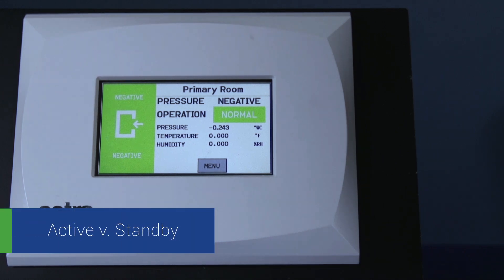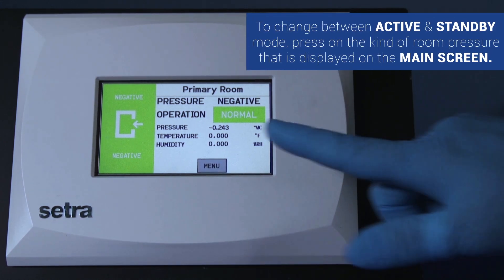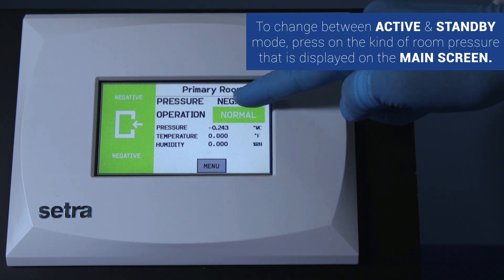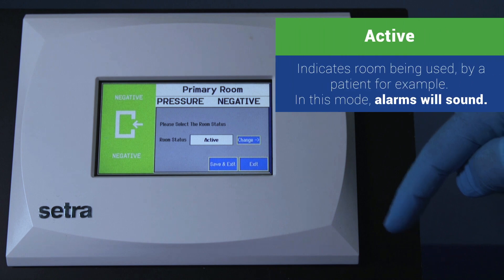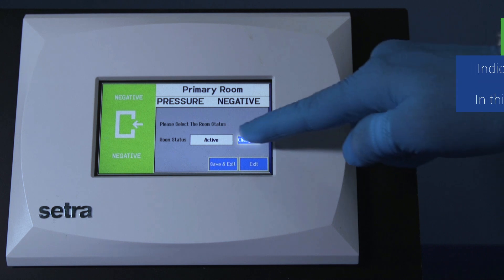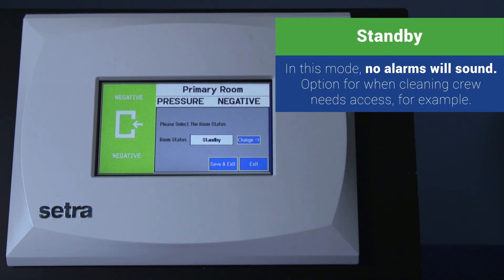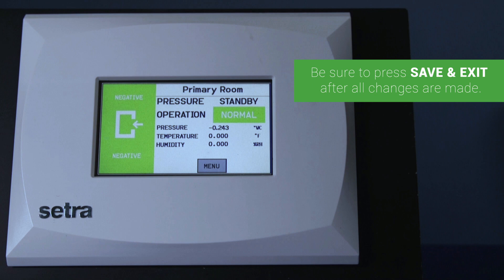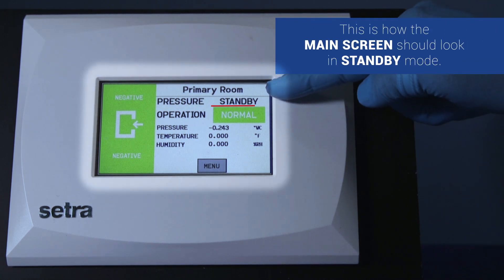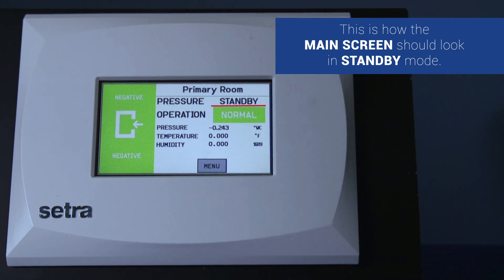Active versus standby mode basically determines if the room is being used or not. To change between active and standby mode, press on the kind of room pressure displayed on the main menu. If the room is being used by a patient, for example, it should be in active mode. If the cleaning crew needs access, it would be in standby mode. In standby mode, no alarms will sound. Be sure to press save and exit after all changes are made. This is how the main screen should look in standby mode — remember, in this mode, no alarms will sound.